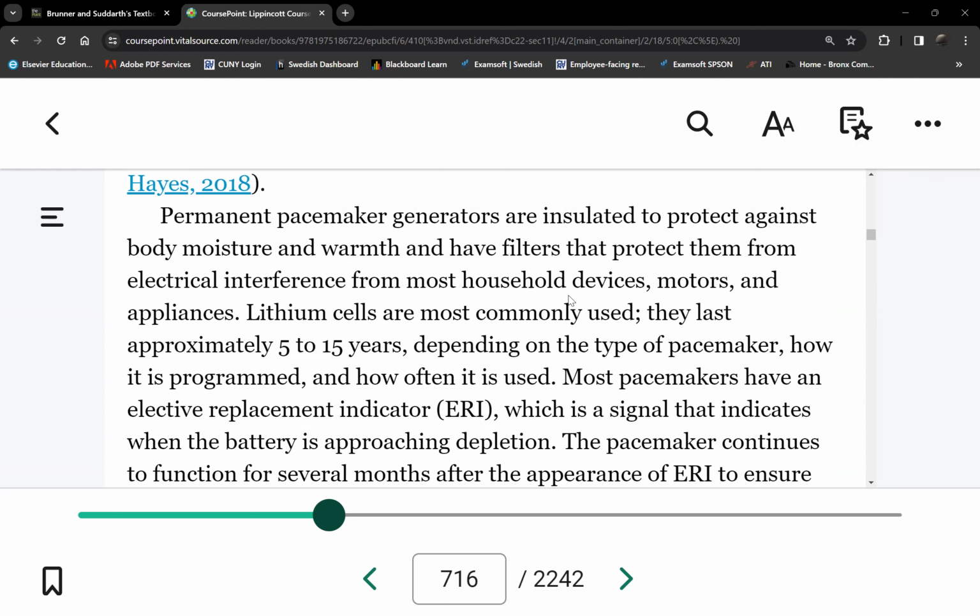Permanent pacemakers. So these are implanted. They stay forever unless, again, something goes wrong or these things get infected, which is rare. Then we'll take them out. The batteries last a long time. Well, it depends on the patient's age. So the younger you are when you get a pacemaker, then likely you'll need a battery replacement during the rest of your life.